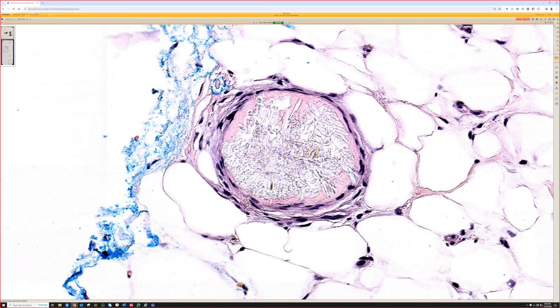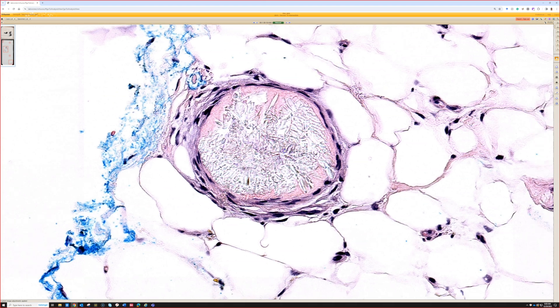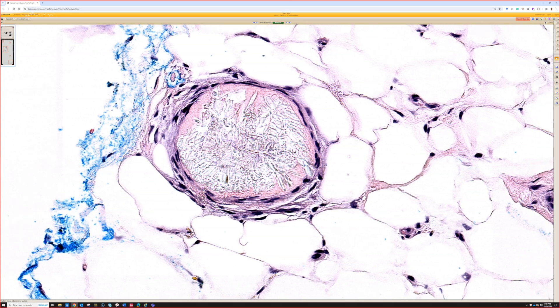If it was just in the adipocytes, I was thinking like, oh, this looks like subcutaneous fat necrosis of the newborn. Good point. But this is inside the vessel, so I think this is good for oxalosis.